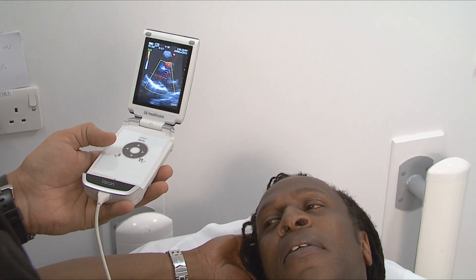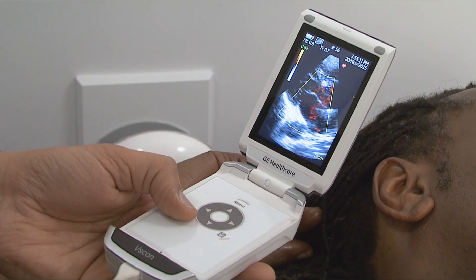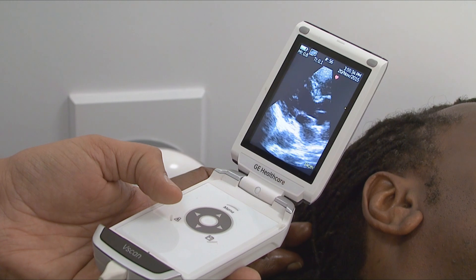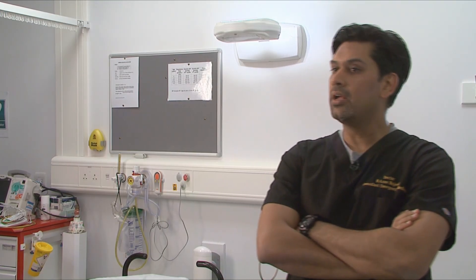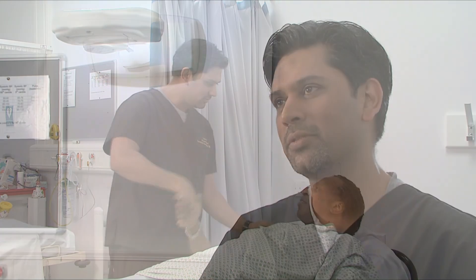With the same probe I could look at the IVC size and see if it was collapsible, giving me an idea whether the patient was fluid overloaded and whether to start diuretics. So with this machine I could cover all aspects. Having something handy in my pocket to assess the chest, abdomen, and heart — it was so easy and handy to use. Simply put, it's a simple, user-friendly machine that's easy to carry around and does the job.